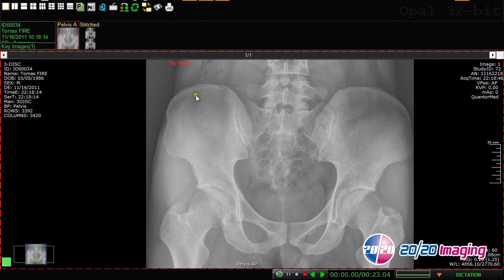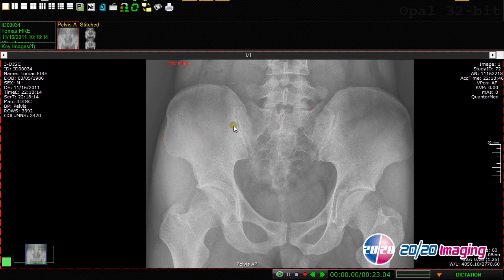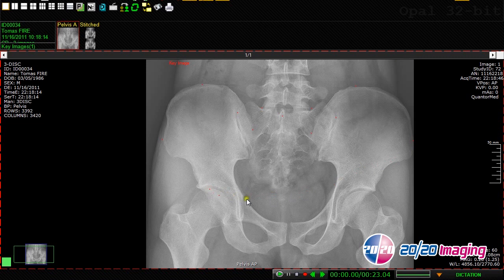First point placed at the top of the left iliac crest, followed by the right iliac crest, the left sacral notch, and the right sacral notch, the first sacral tubercle, the lateral aspect of the left iliac, the lateral aspect of the left sacrum, the medial aspect of the left iliac, the medial aspect of the right iliac, the lateral aspect of the right sacrum, the lateral aspect of the right iliac, the top of the left femur head and the right femur head, the center of the symphysis pubis, the bottom of the left ischial tuberosity, and finally the sixteenth point at the bottom of the right ischial tuberosity.